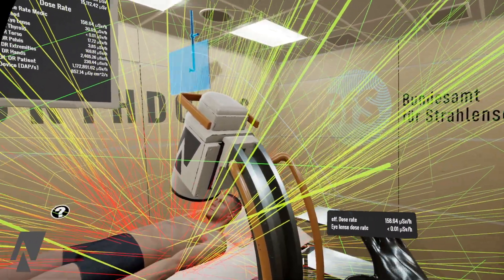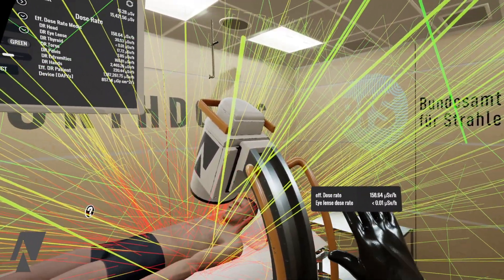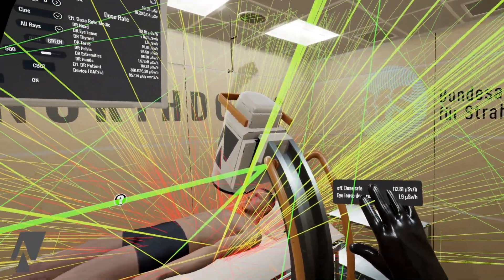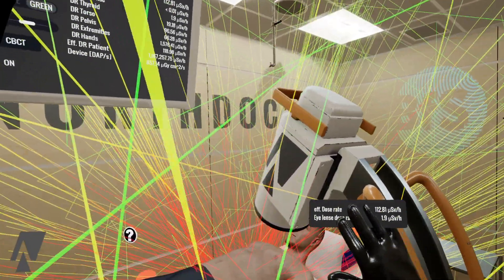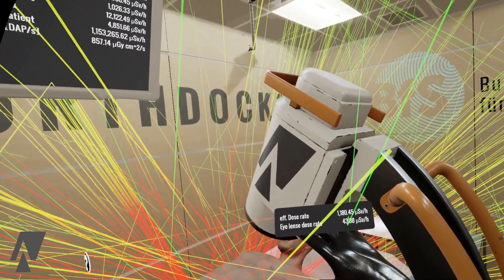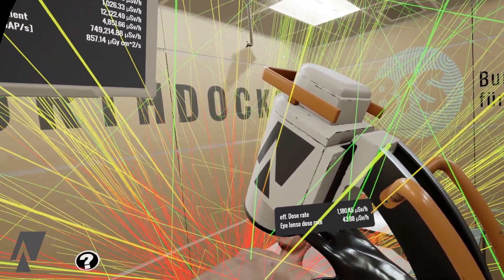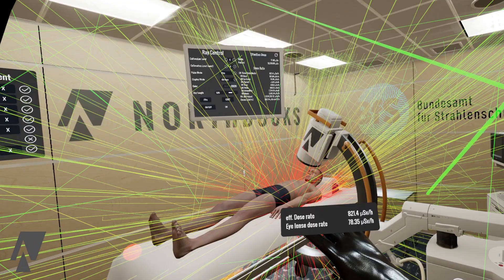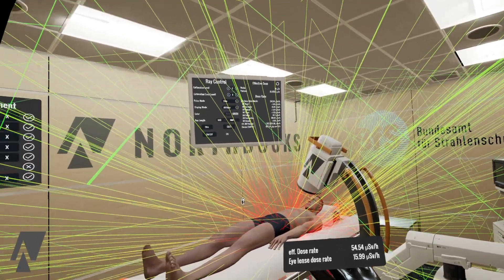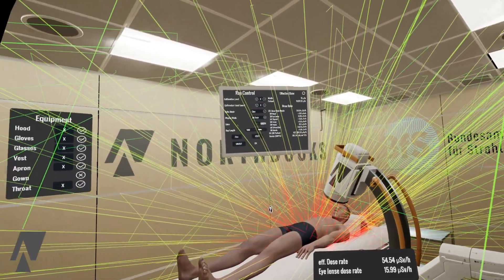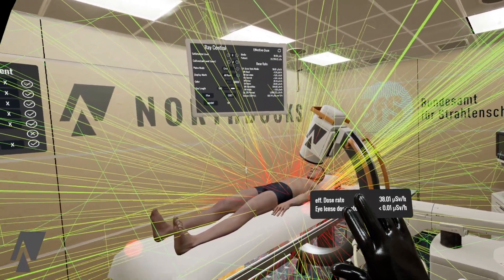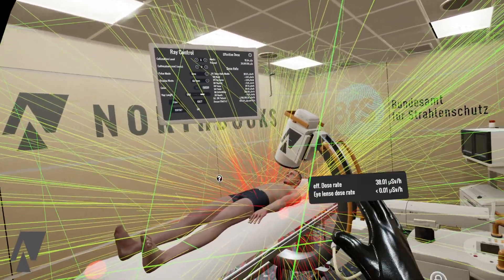As you might have noticed on my right hand, I have some effective dose rate constantly, so I can really look at how that changes when I move through the room, move closer to the source or farther away. All of these things help raise awareness of where to stand, what to wear, and how to adjust the device.